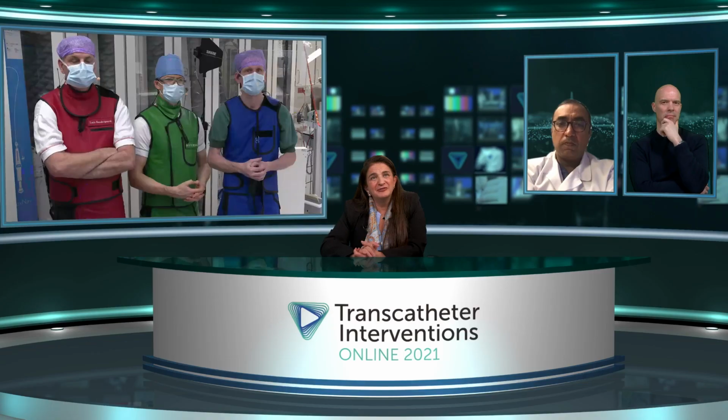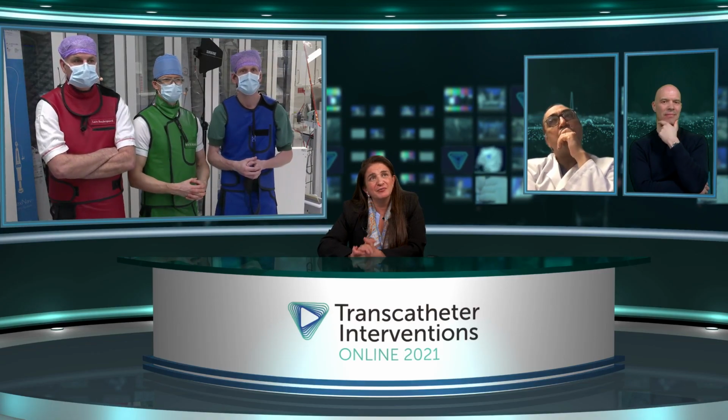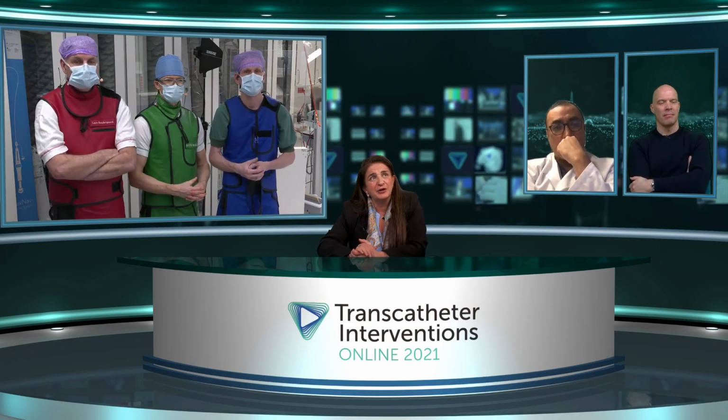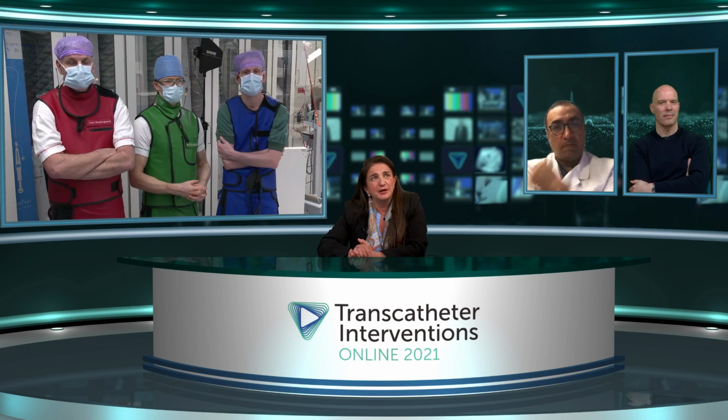All right, fantastic, really great work. Lars, what are you doing for the antiplatelet regimen? Is there an antiplatelet regimen for this patient, and what happens with their NOAC?